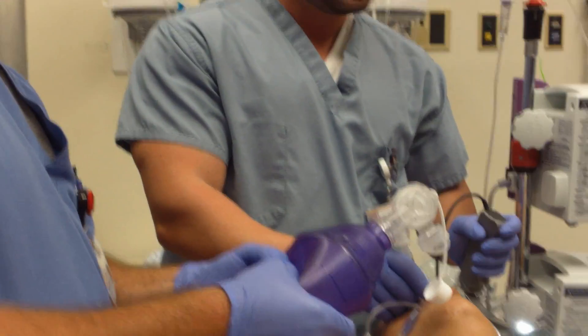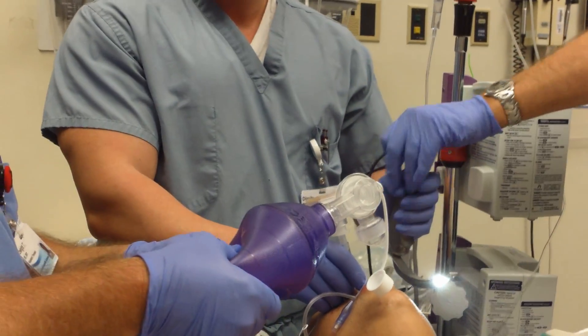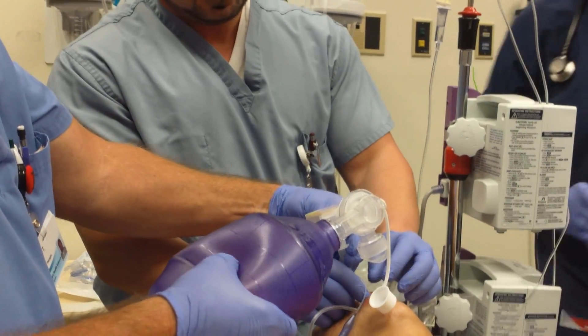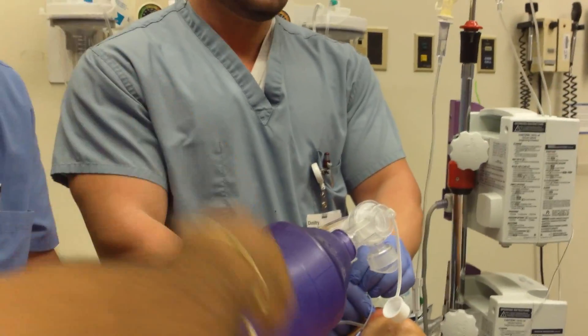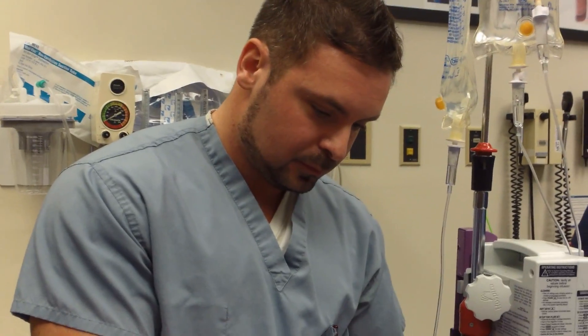So now we'll secure that and then we'll have to put an NG in. Just hang on the tube and we'll get a tube tie in. Pull back a little bit — there's 26 at the lip. She's going to pull back — there's 23 at the lip.